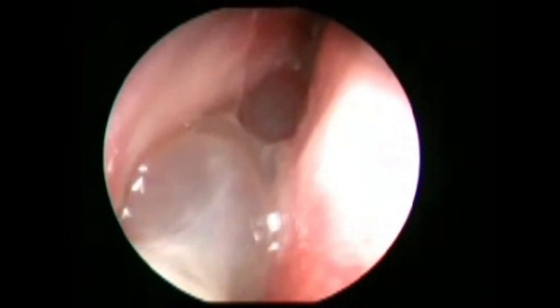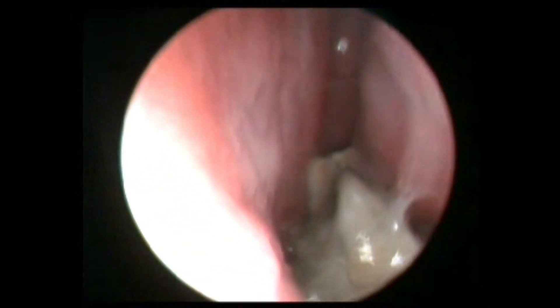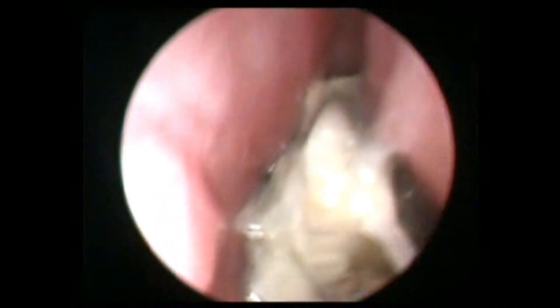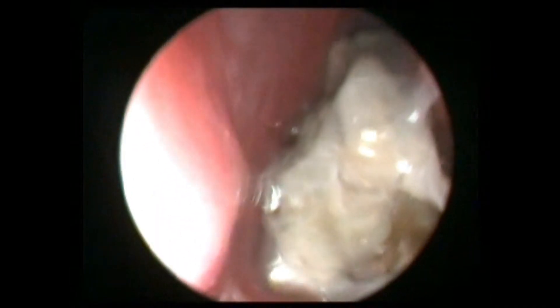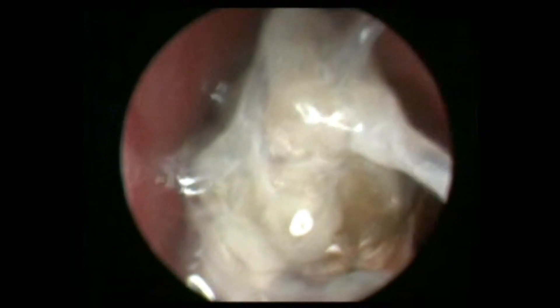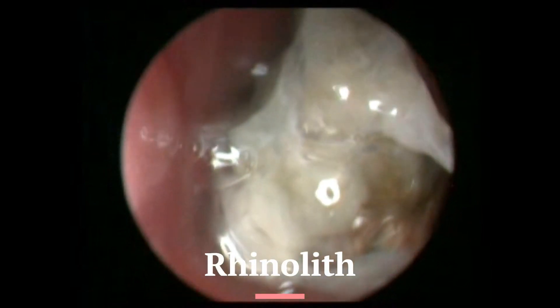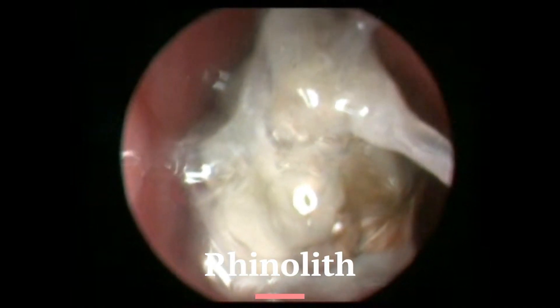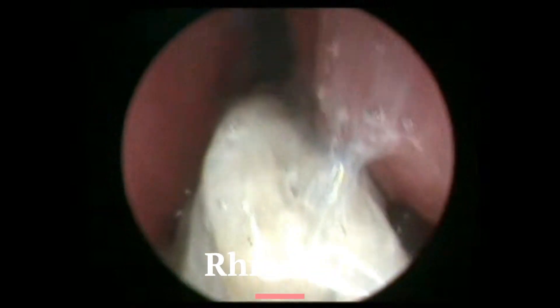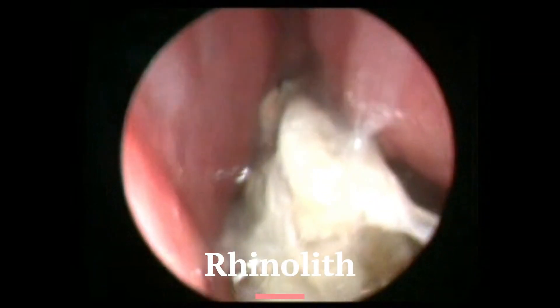This is a case where a foreign body has turned into a stone-like thing, known as a rhinolith. It is occupying the nasal cavity and usually can be diagnosed on the first pass only — hard and gritty on sensation. Often the patient gives a history of unilateral nasal blockage and discharge, sometimes with headache secondary to sinusitis.